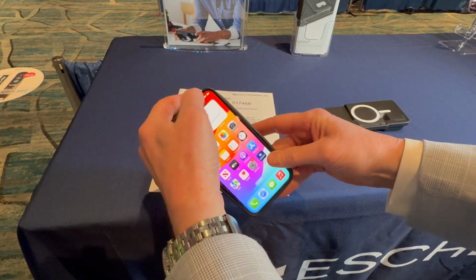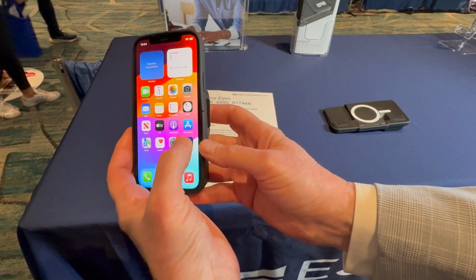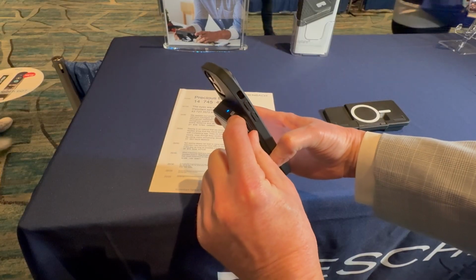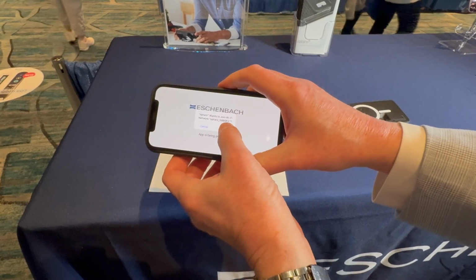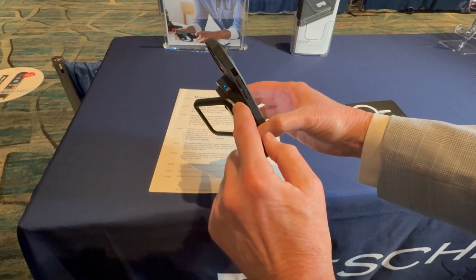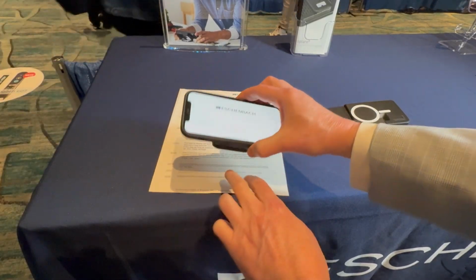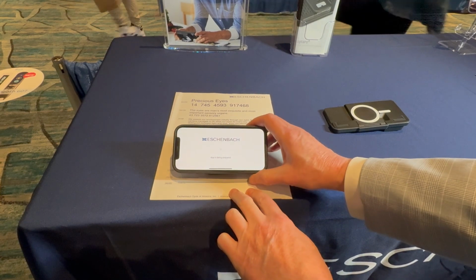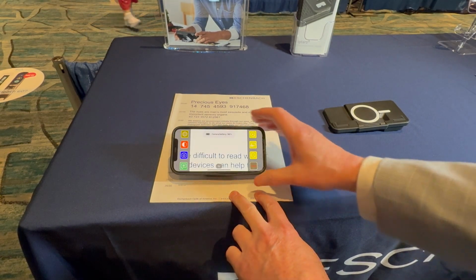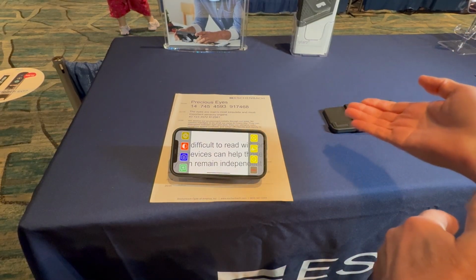There's a free app from the App Store called Optaro as well, and so you just press on the Optaro app, you turn on the camera, which this already is on with the blue light, and it's going to ask to join. And when you're joining, what's happening is that the device is actually making its own little Wi-Fi signal to project the image from the camera onto the screen of the iPhone. And so when that comes on, it'll give you a magnified image of the object being viewed, but give you the full functionality of a video magnifier.